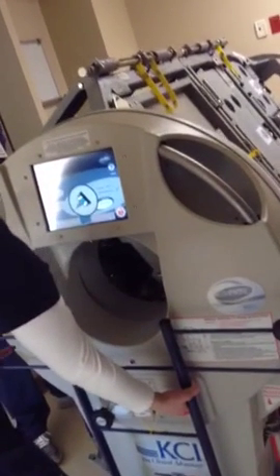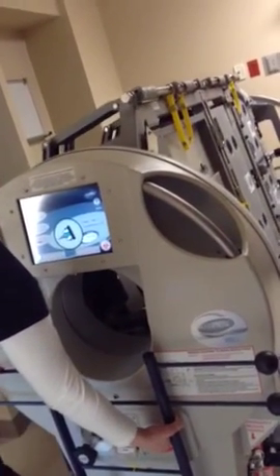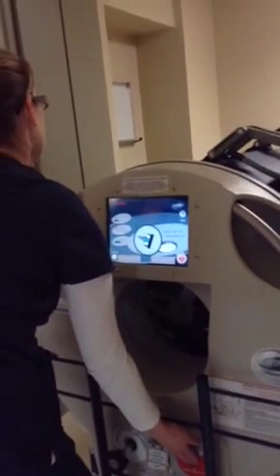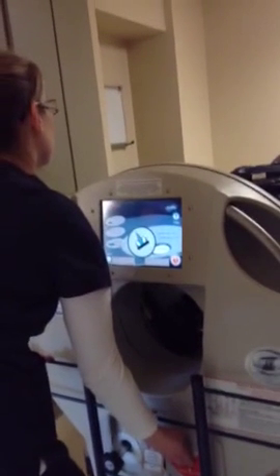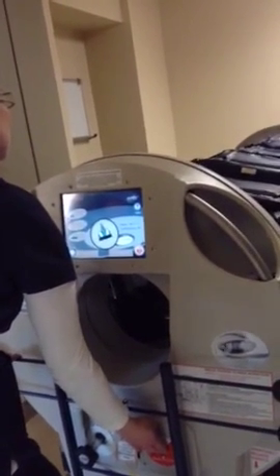So now, y'all come down and we'll look at the foot of the bed, how to do that if you have to use it. Which we did down the hall. We had a problem with that bed down the hall, and we had to manually turn it, because there was something wrong with the sensor. Go to the bar and I stuck a fork in it. Fixed it.